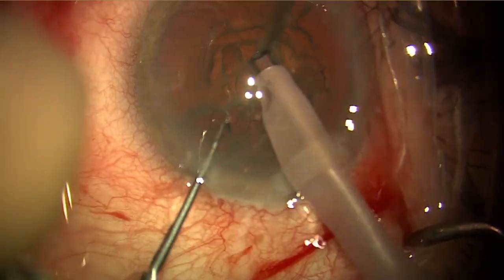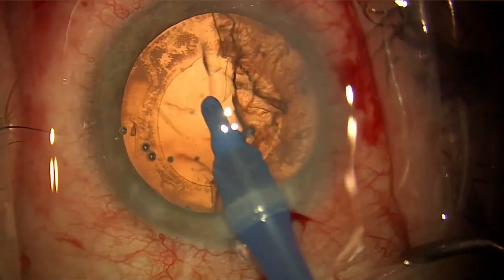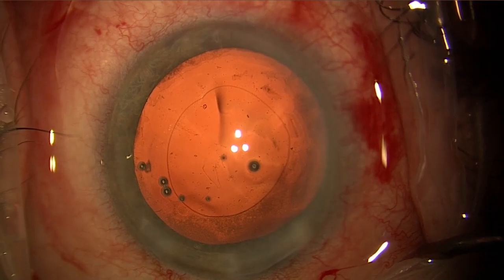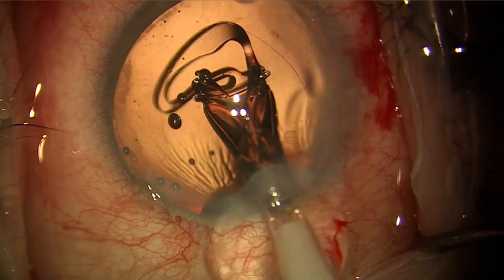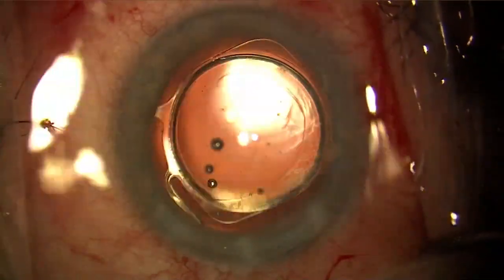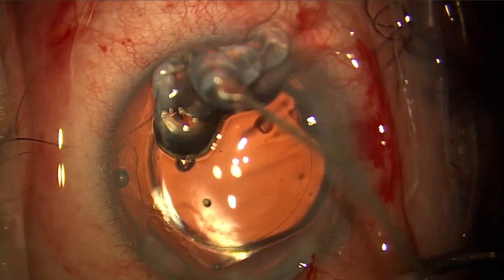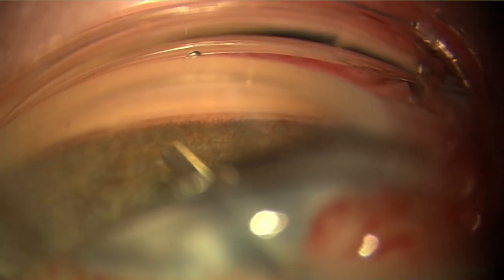First, it's a relatively soft lens with a mild cataract, and the cataract is removed relatively efficiently. The IOL is placed into the capsular bag, and then we are going to put some Healon GV into the eye, some Provisc on the surface, and secure a gonioscopic view of the angle. And we have a clear view of the trabecular meshwork.